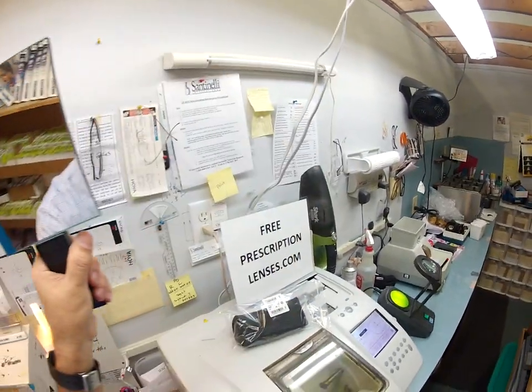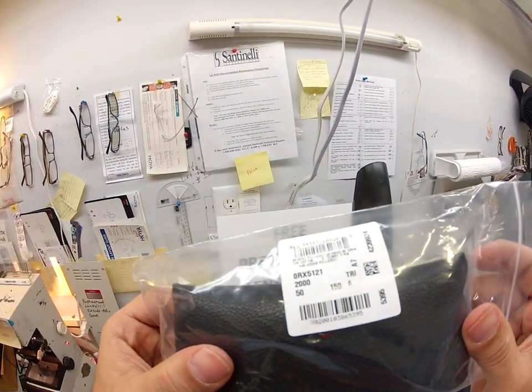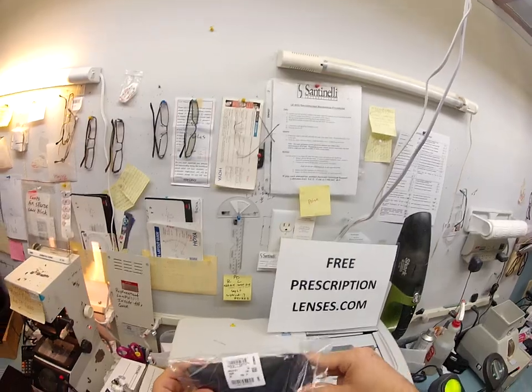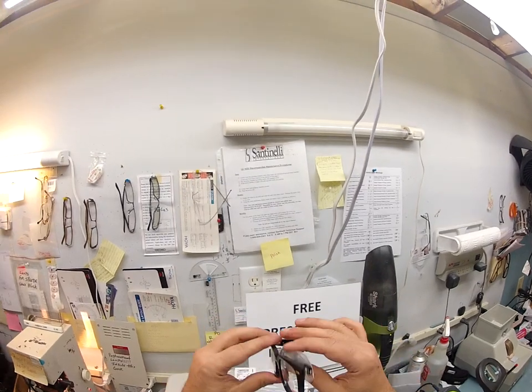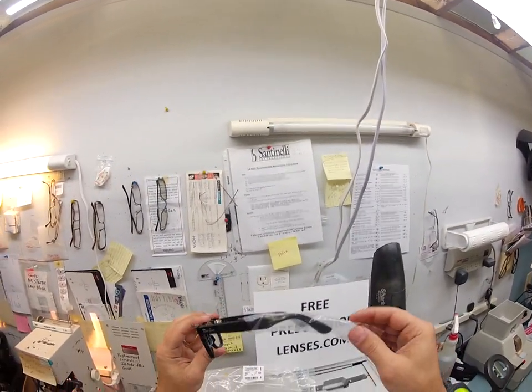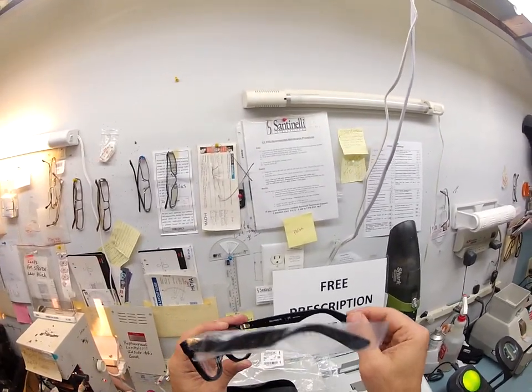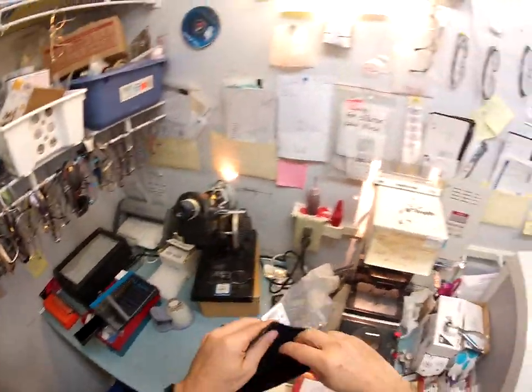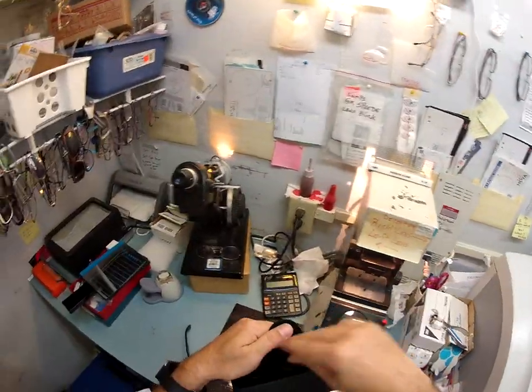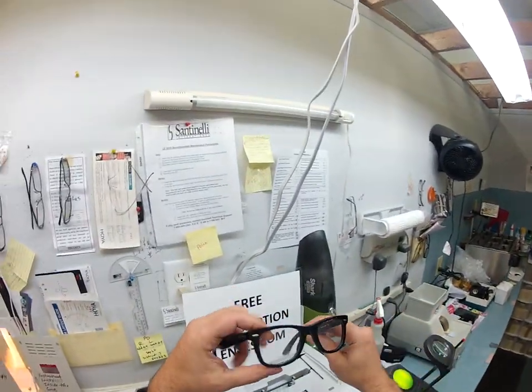Hello, Christopher Matthew here with FreePrescriptionLenses.com. With the help of my GoPro camera I'm going to show how I cut your transition bifocal lenses for your Ray-Ban 5121, color 2000, size 50 — the shiny black. You get your Ray-Ban Wayfarer case and frame with a little plastic sleeve. I'm going to send you all the original packaging and demo lenses, and add one more sleeve to the right side for shipping. In your Ray-Ban case you get a black Ray-Ban cloth, one of my cleaning cloths, and instructions on how to care for them.